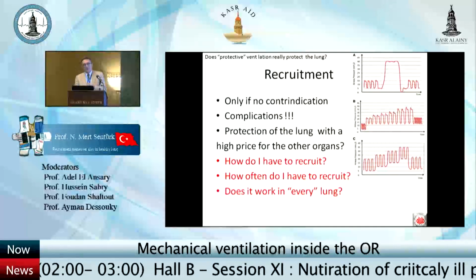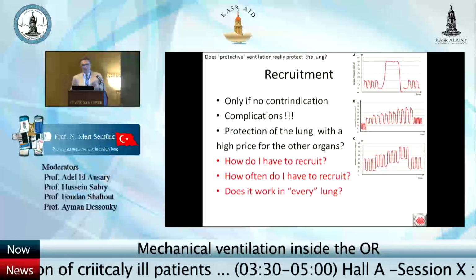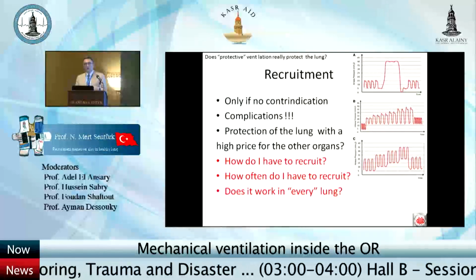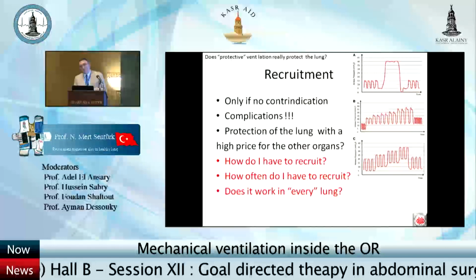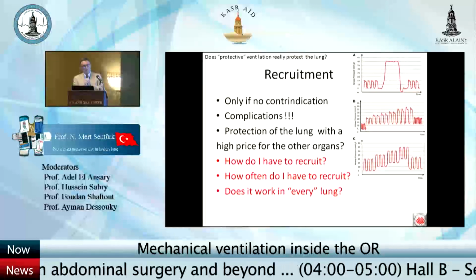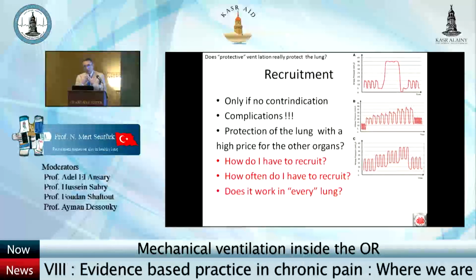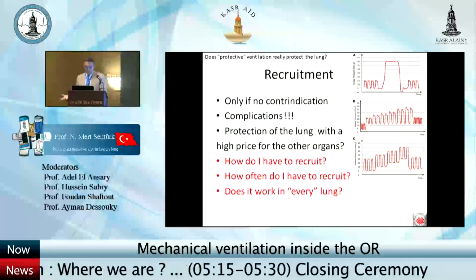As I have mentioned before, if your patient has bullae that can explode and cause a pneumothorax, it's a contraindication. You cannot apply your recruitment maneuver in a hemodynamically unstable patient. Do not apply the recruitment maneuver in a hypovolemic patient. Every time you apply this recruitment maneuver, you can have a very hypotensive patient, hemodynamic instability, and therefore this can be more harmful than beneficial.